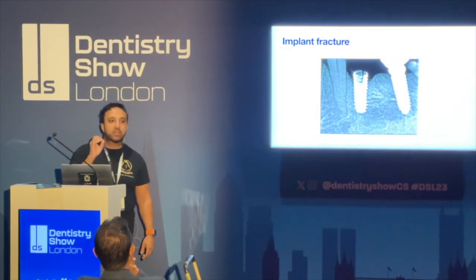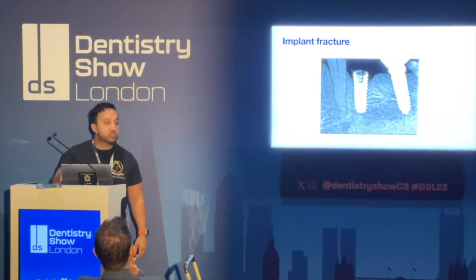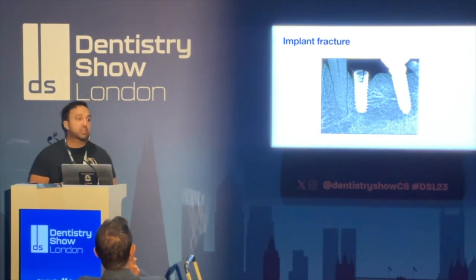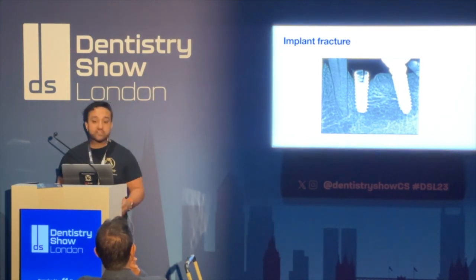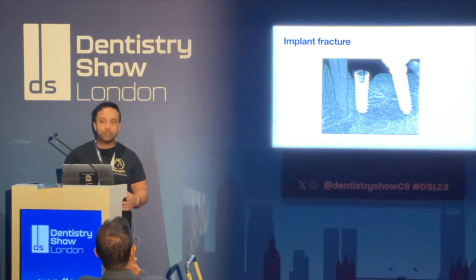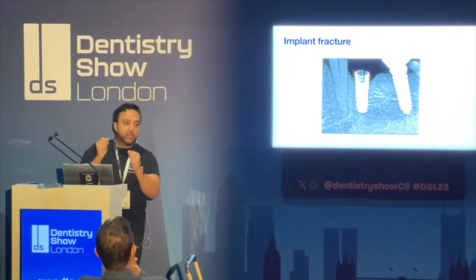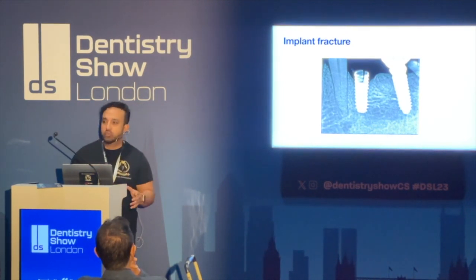Fractures of implants are very, very simple to diagnose. Either from the X-ray that you take, you see something as obvious as this, that's fractured, and that's a clear occlusal issue that may have occurred, or the wrong implant design with very thin walls that causes fracture, or the patient's bruxism, or there's an interference on the lateral guidances. Okay? So we need to work out what's caused that. The second thing is, obviously, this implant is unrestorable.